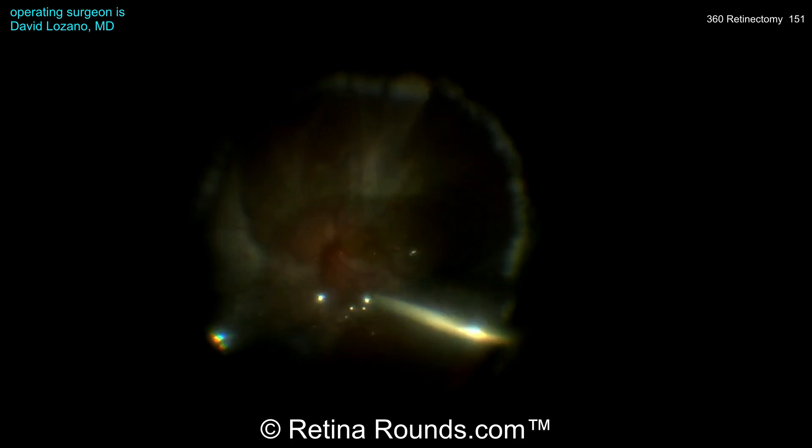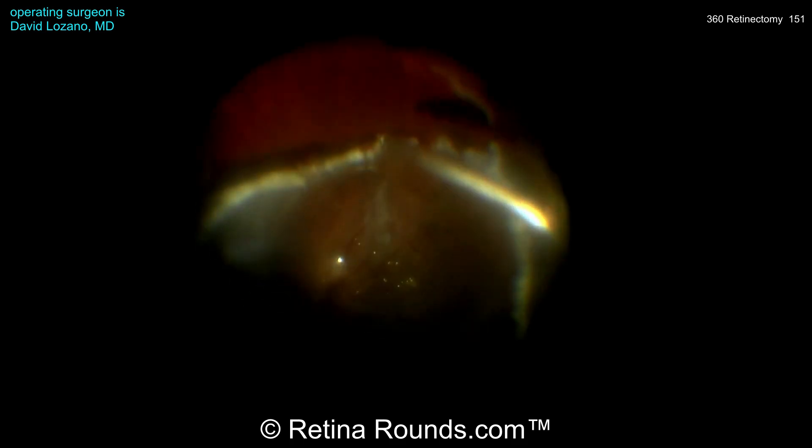Now you can see that Dr. Lozano is applying some diathermy, which is going to delineate the edge of the retinectomy. The purpose of this is that there are a number of retinal blood vessels that can bleed during creation of the retinectomy, so preemptively he's applying diathermy to decrease the risk for bleeding. There are different approaches: you can perform an almost confluent diathermy as Dr. Lozano is showing here, which helps minimize bleeding risk and reduces the need for multiple instrument exchanges. The other approach is to diathermize only the major vessels and then address any small oozers as the retinectomy is being created.